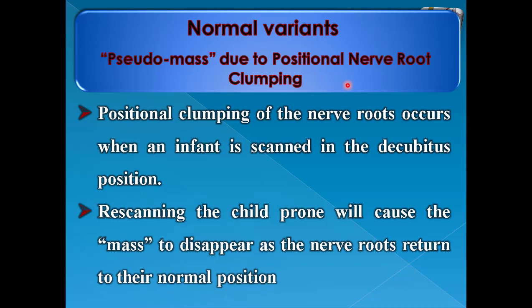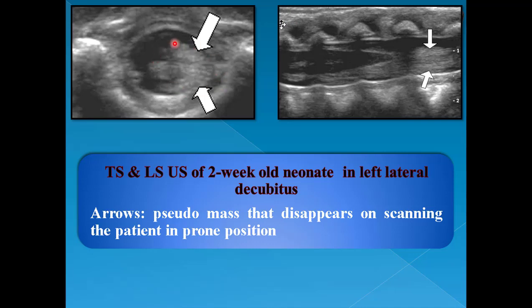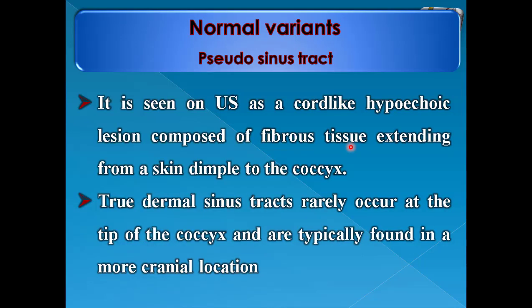Another normal variant is pseudomass due to positional nerve root clumping. Positional clumping of the nerve roots occurs when an infant is scanned in the decubitus position — either right or left lateral. Re-scanning the child in the prone position will cause the mass to disappear as the nerve roots return to their normal position. This can be distinguished from true pathology by changing the patient to the prone position.